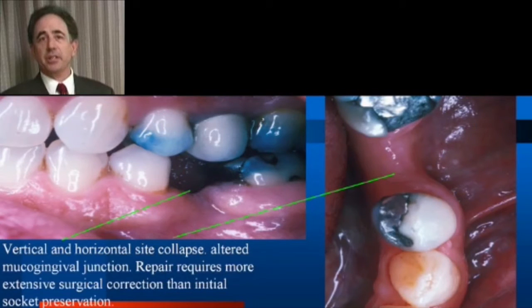Look at any patient that presents to your practice. Where there is an extracted tooth, if the site has not been preserved, you will see deficient alveolar bone and gingiva for the placement of either a fixed bridge pontic or a dental implant. These sites must be reconstructed for the placement of a fixed prosthesis if we want an ideal aesthetic result.